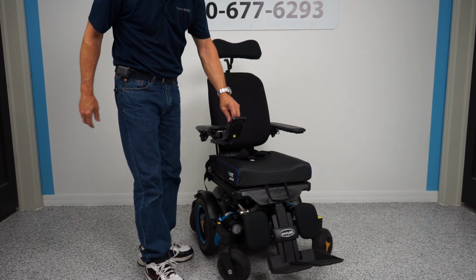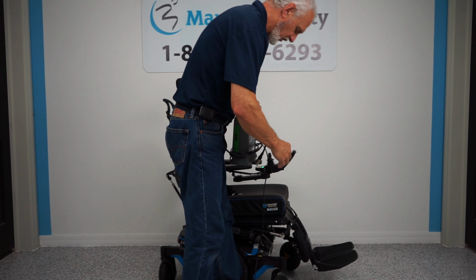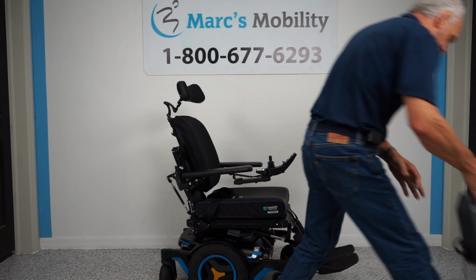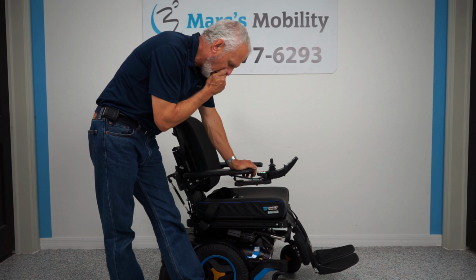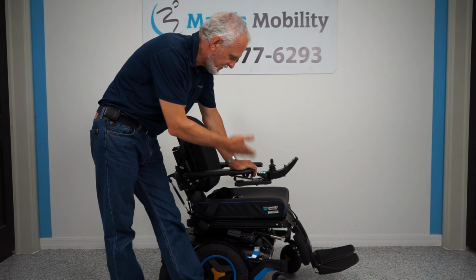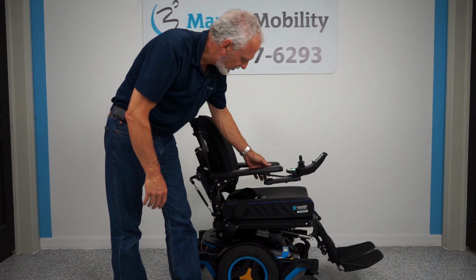All right, so when you charge this chair, you'll take your Permobil charger and plug it right below your joystick, right here. As soon as the light goes to full, the charger will stop charging. This chair has about a 15-mile distance in one charge, so it all depends. If you're outside going uphill in the grass, you may not get 15 miles. If you're using the tilt or recline, you may get more if you're on a flat surface. So the mileage varies for everybody. It also depends on the weight of the user.